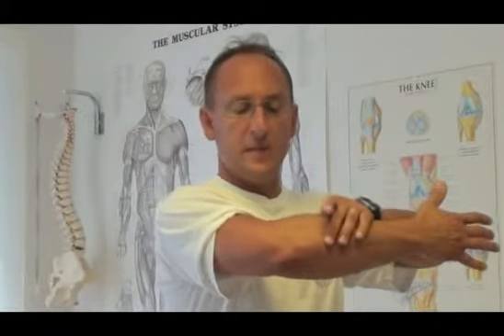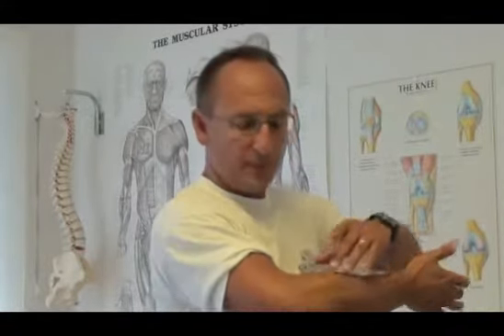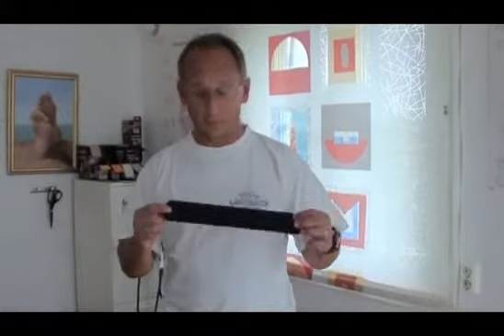So what we have to do when we examine the patient is to see: does it give pain when I press the muscle outside, or does it give pain when I press it inside, or does it give more pain if I press it up, or more when down, or in the other direction? Because when we have a patient with a tennis elbow, they will say, this gives release when you go that way, but it gives more pain if I go the opposite direction. Okay, that means we have to put a tape on the elbow which will give a release from the pain. So we call it correction techniques. I will show you later how we in Rehab Tape in Sweden treat a patient with a tennis elbow. Okay, let's try to put this on his tennis elbow.